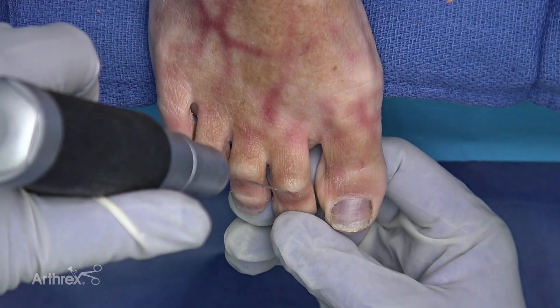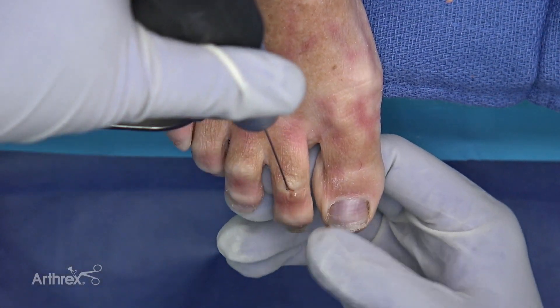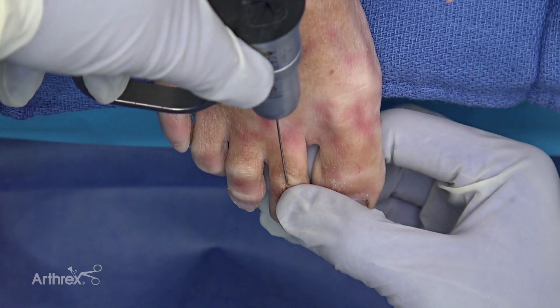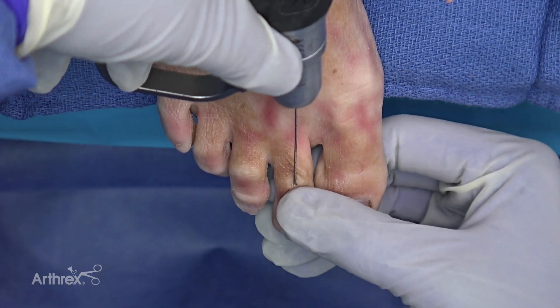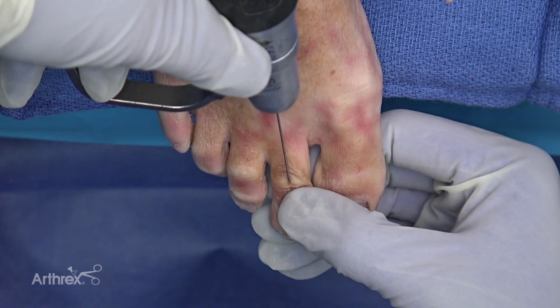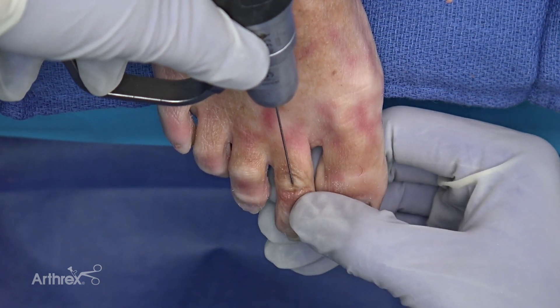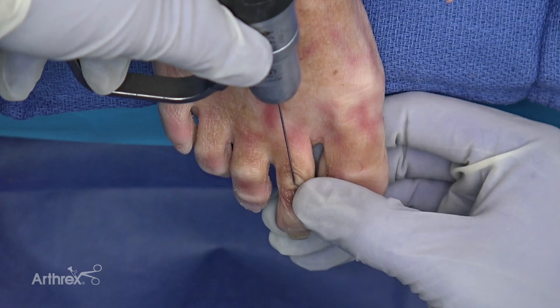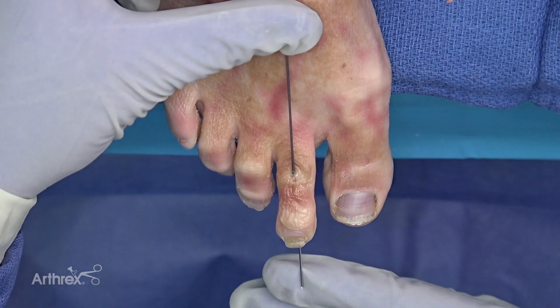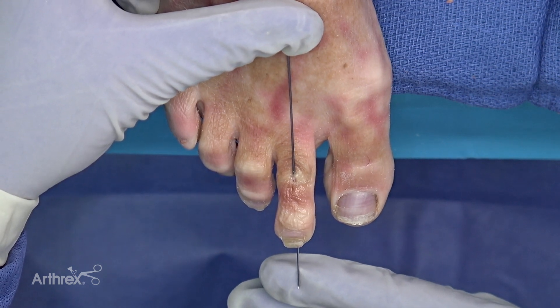Next we're going to place in a retrograde fashion the 0.8 millimeter guide wire for the 2 millimeter drill so that we can prepare the middle phalanx. We're going to send this out ideally through the tip of the distal phalanx, because once again our overall alignment is contingent upon our guide wire placement and our drilling. I'm looking at my position here and it looks good, but it's really important to check this under fluoroscopy.